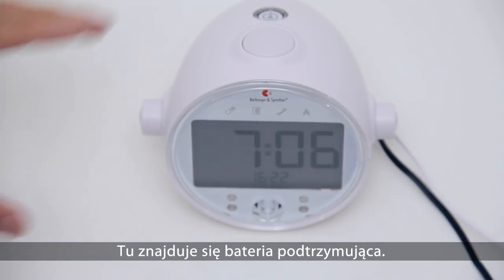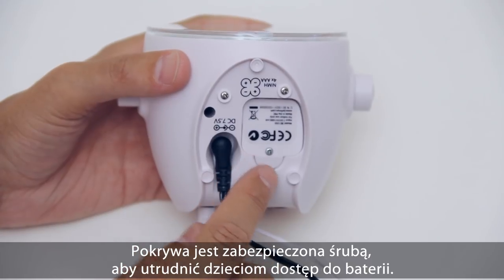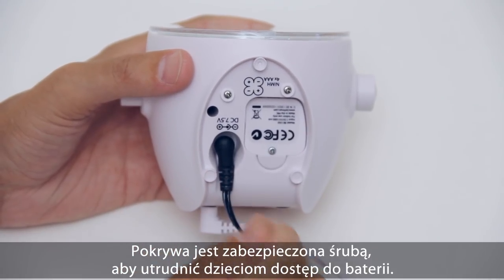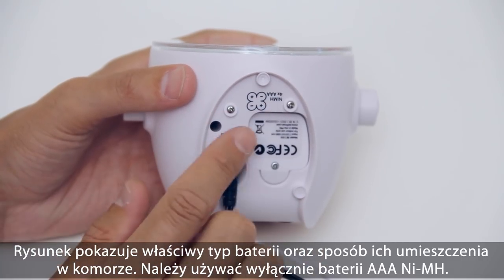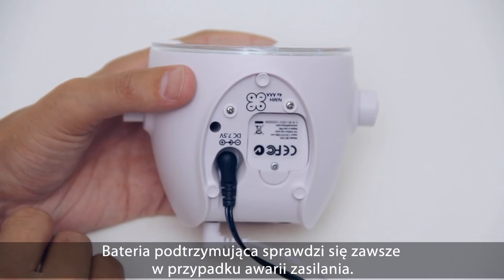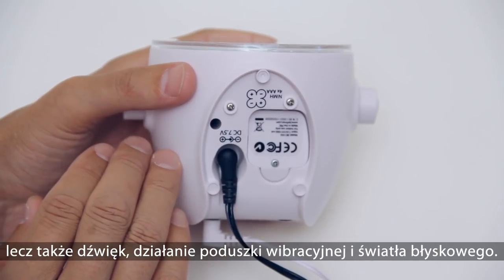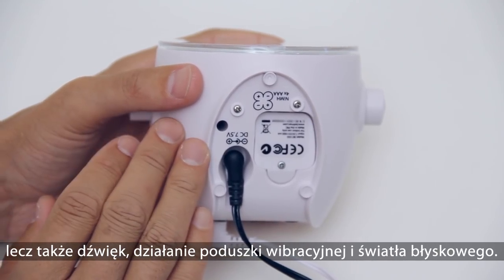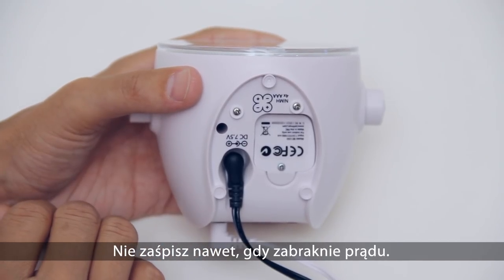You will find the backup batteries here. The battery lid is secured by a screw to prevent small children from opening it. A print shows the correct battery type and how to insert them — be sure to only use triple-A nickel metal hydride batteries. The clock's powerful battery backup will step in whenever the power goes out. The backup battery does not only keep the time — it also keeps the sound, bed shaker, and flashing lights at full power, meaning you'll be awakened even if the power went out while you were asleep.